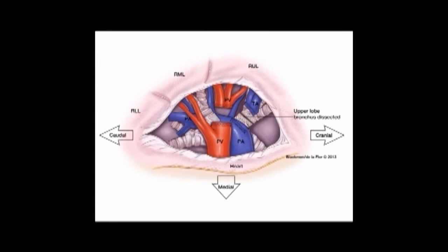Once the truncus anterior branch of the pulmonary artery has been divided, the next structure encountered is either the right upper lobe bronchus or the posterior ascending pulmonary artery. These structures are typically right next to each other. We do not recommend that one be divided in front of the other, but instead recommend that you see which one has the most reasonable angle. Based on that decision, you can divide either the right upper lobe bronchus or the right upper lobe branch of the posterior ascending pulmonary artery. Once the bronchus has been divided, you can then encircle, staple, and divide the posterior ascending branch of the pulmonary artery.